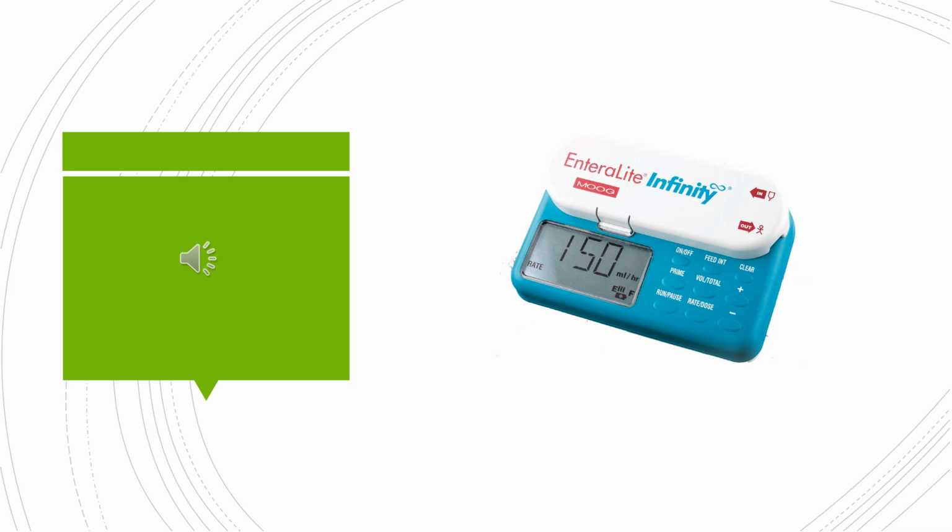People can receive tube feedings via bolus, using gravity bags, and utilizing a pump. A feeding pump delivers tube feeding at a specific prescribed rate. The settings should never be tampered with unless instructed to do so by a physician.